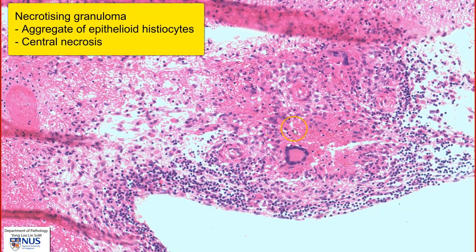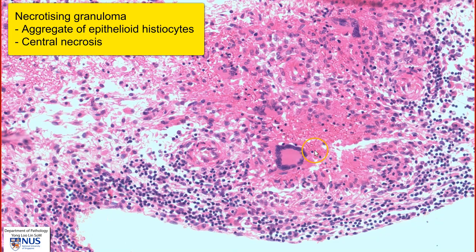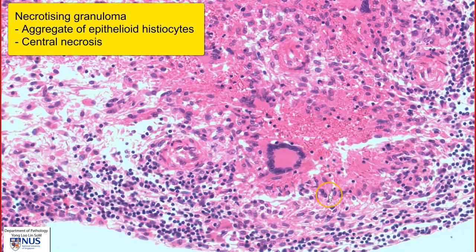Over here, we can see a necrotizing granuloma. We have epithelioid histiocytes or macrophages, which form the granuloma. And then within the central area, there is this amorphous eosinophilic material, which is necrosis — hence, necrotizing granuloma.